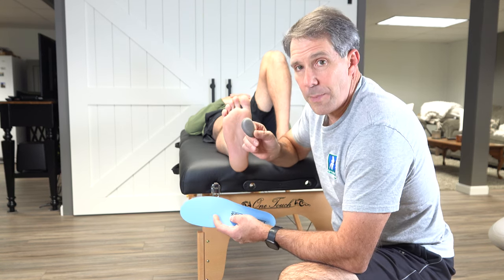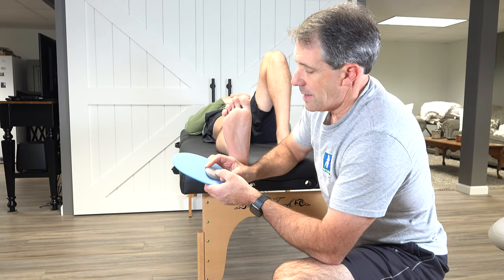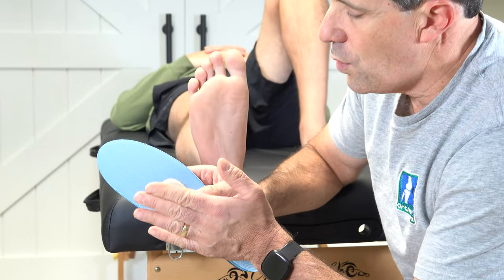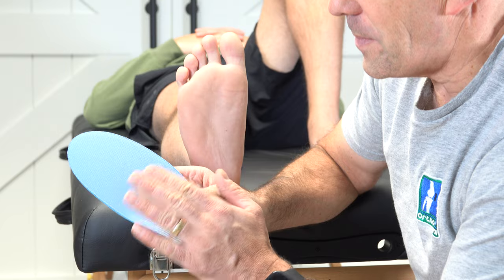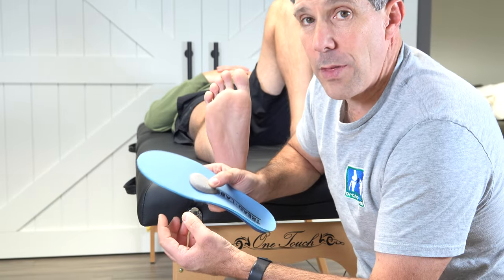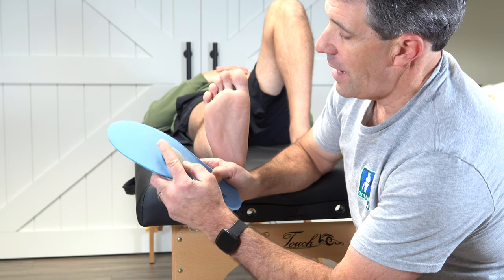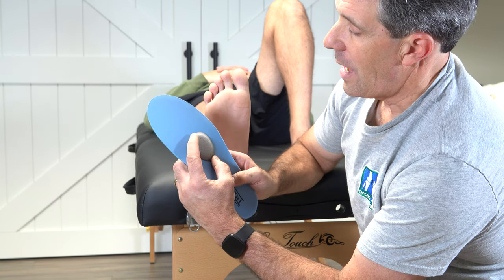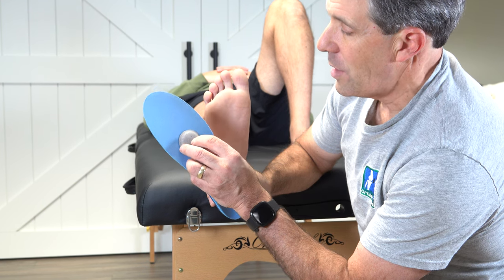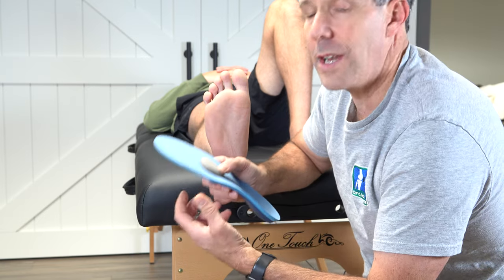It's generally this little teardrop device here that usually comes in an orthotic, and it's sometimes built into it. It's there to try to act as a little bit of an arch builder for this part of the foot. The one thing I don't like about the ones that are already built in is that sometimes they're not in the right position — they may not be up high enough or back enough, or they may not be in or out enough. They're always in a standard position, and not really all that custom or individual for the person.